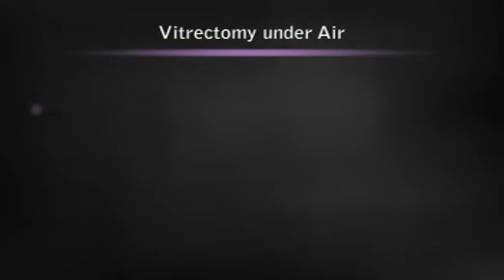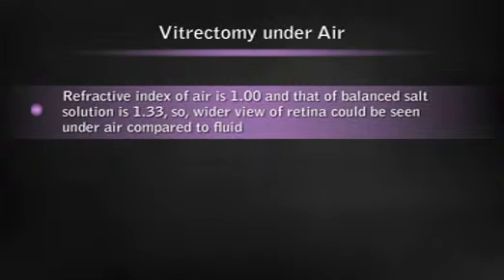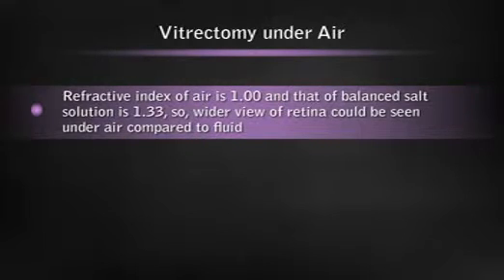Fluid-air exchange is used for performing endolaser, drainage of sub-retinal fluid, and tamponating the retina at the end of surgery. As the refractive index of air is 1 and that of fluid is 1.33, a wider view of the retina could be seen under air than that would be seen under fluid.